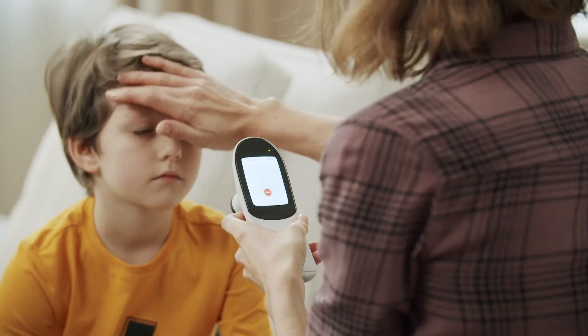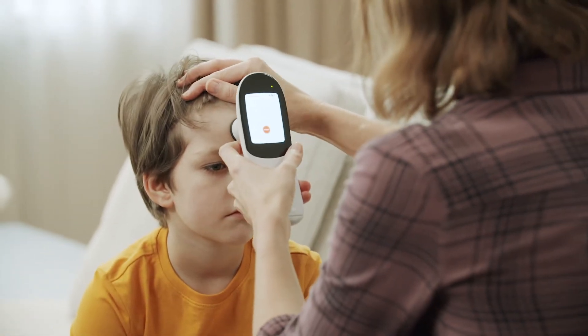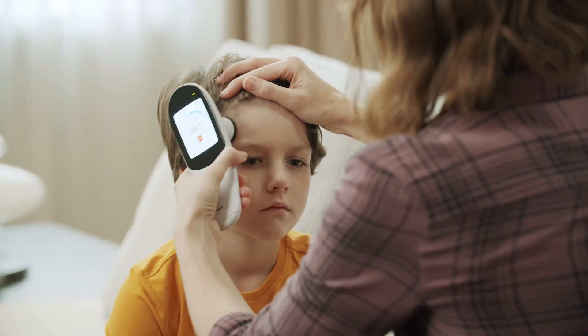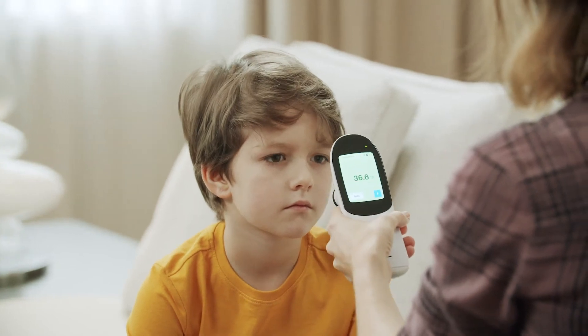Take the temperature by placing the thermometer on the centre of the forehead, then slide it to the top of the ear. It doesn't matter which way. Keep the module in contact with the skin at all times while scanning the forehead.